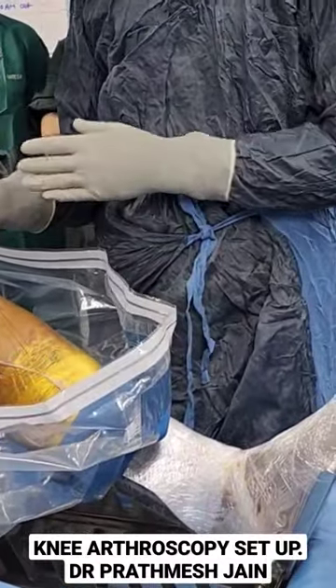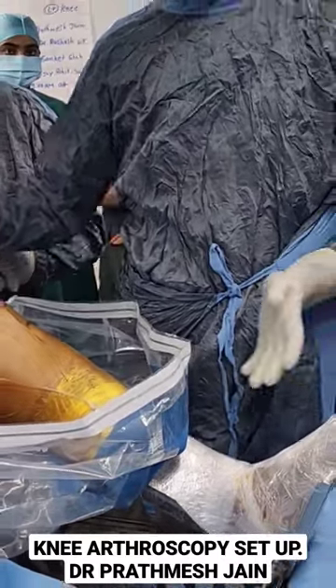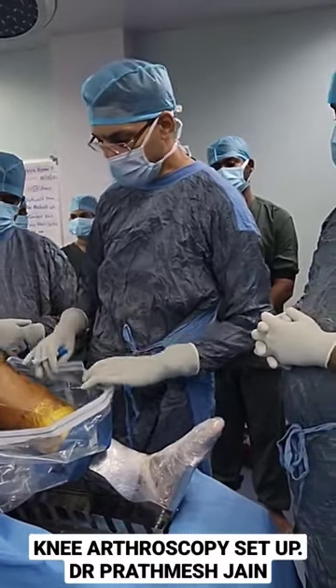If you want to give a valgus stress, you can use the side support, or you can ask your assistant to help, and you can easily turn it around into a figure-of-four position as well.